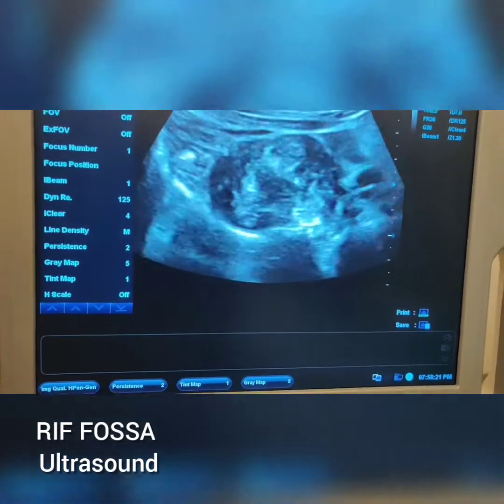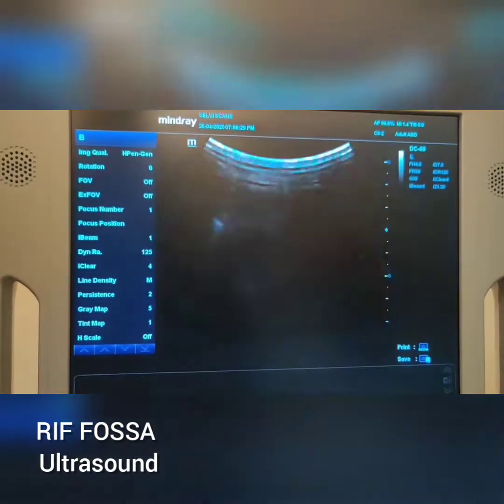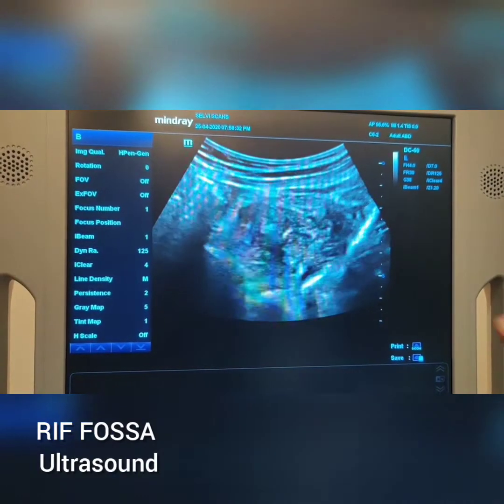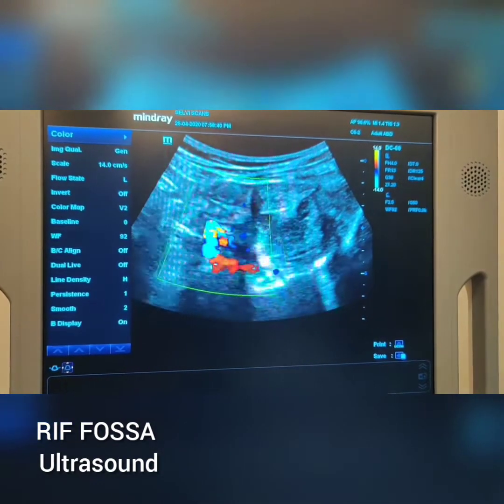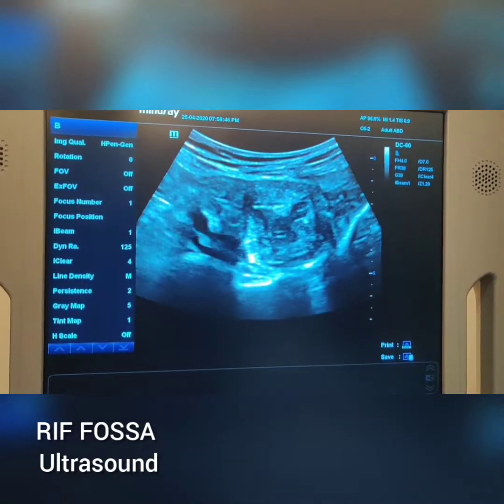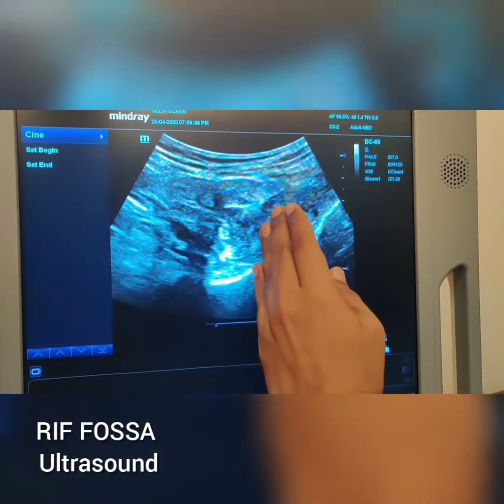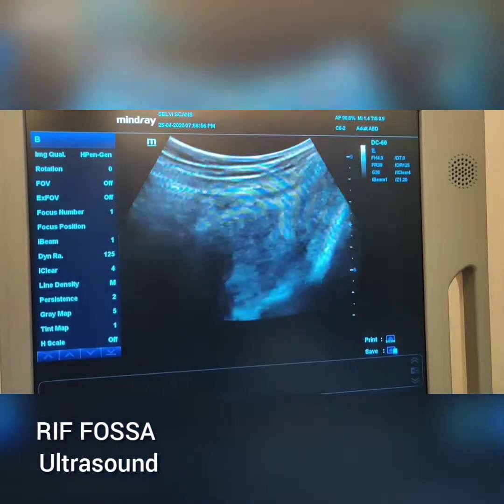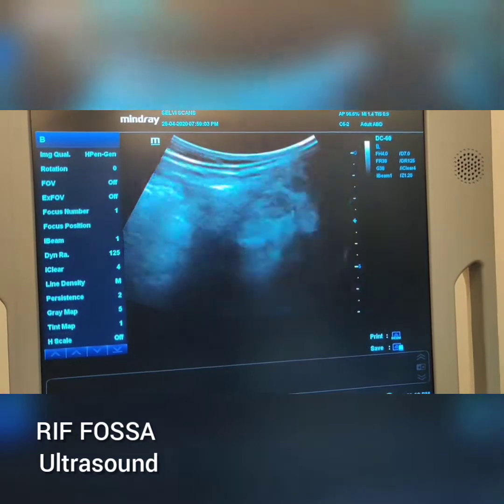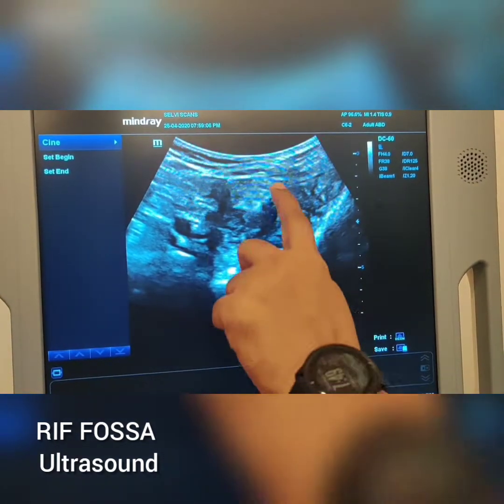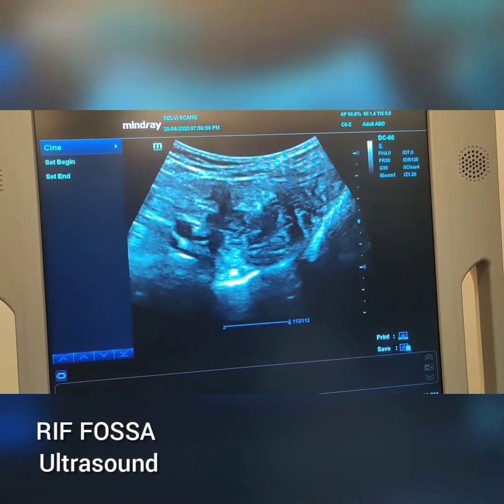If you want to give the spot for the iliac vessel, the image should have three structures: the iliac crest, the iliopsoas muscle, and the iliac vessel — that's going to be the right iliac fossa. Now going to the left iliac fossa — I'm seeing the left iliac crest, the iliopsoas muscle, and the iliac vessel with color flow. The left iliac fossa is used to look for the left ovary in females, or an ectopic kidney in males. Keep the marker on the left-hand side. When I make it long, the iliac vessel will become long — those are the three structures for the left iliac fossa spot.